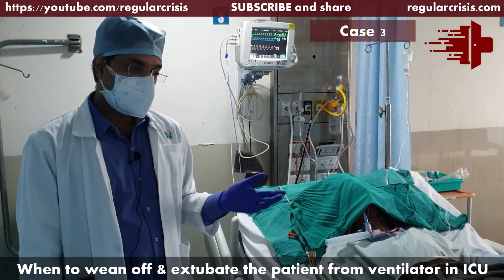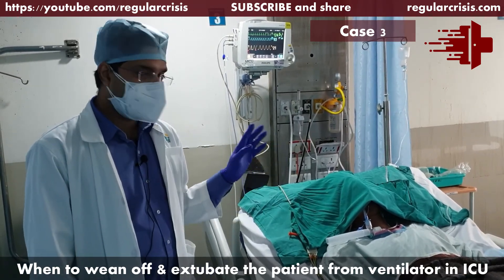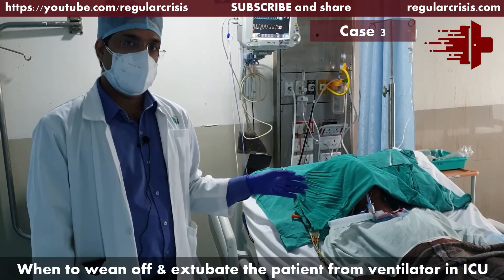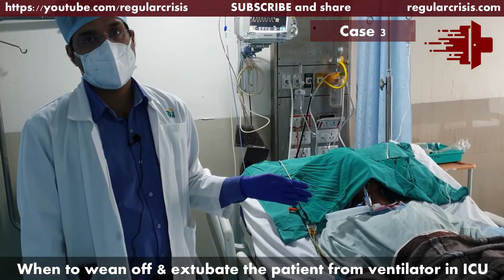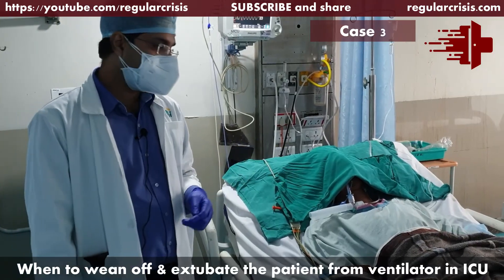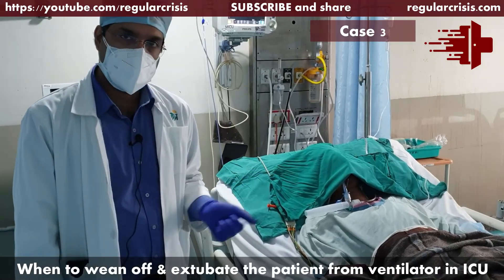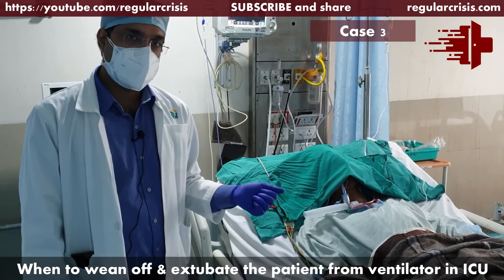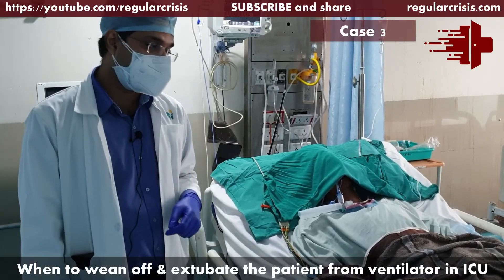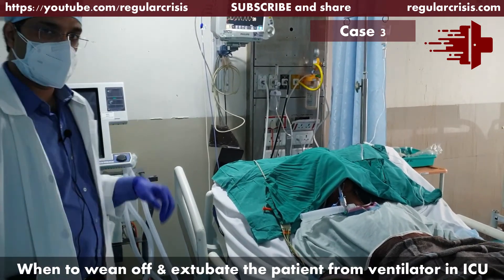Now we move to the last and third case. This is a young patient with bilateral pneumonia on day six or seven, and we need to decide whether to extubate. Step one, primary pathology: there is definitely improvement — the pneumonia is resolving, x-ray is showing improvement, and FiO2 requirement has decreased. Step two, consciousness level: the patient is conscious, following some commands, but his cough is not very satisfactory — he tries to cough but it's not adequate. Step three, hemodynamic stability: the patient is not on any vasopressor support — that's a good sign.